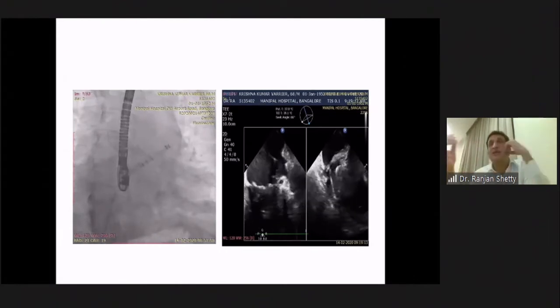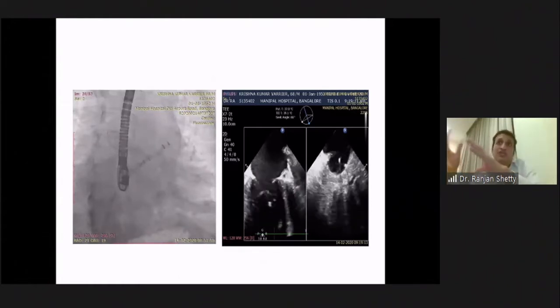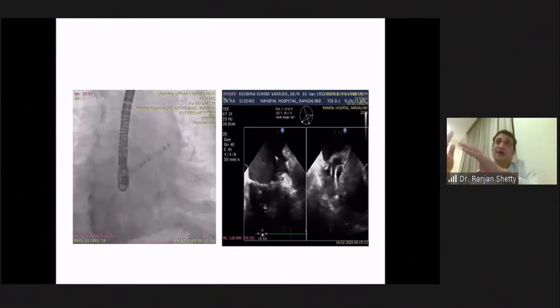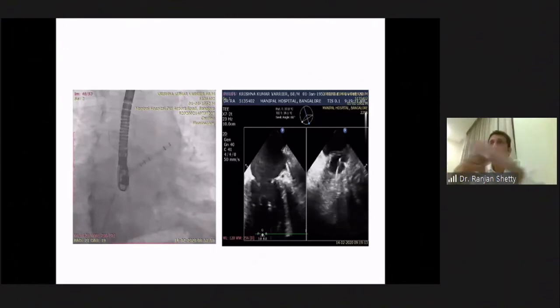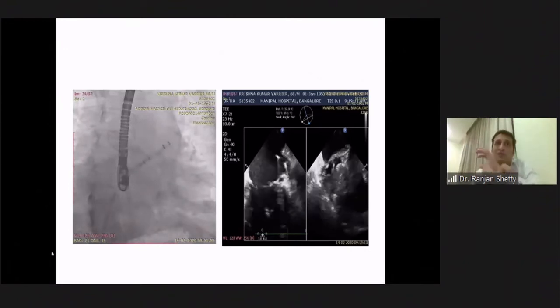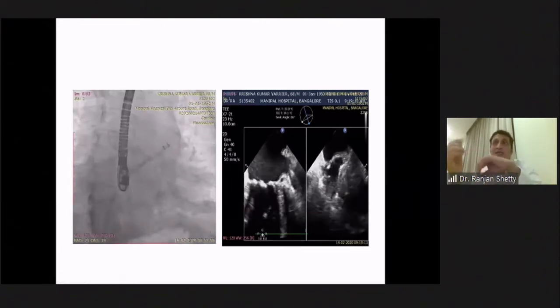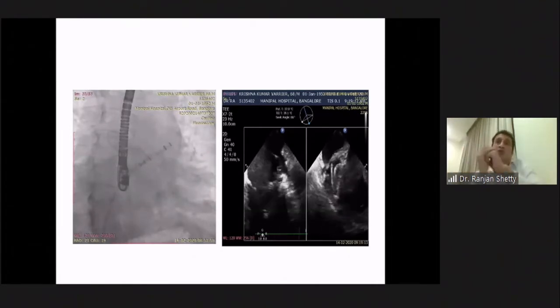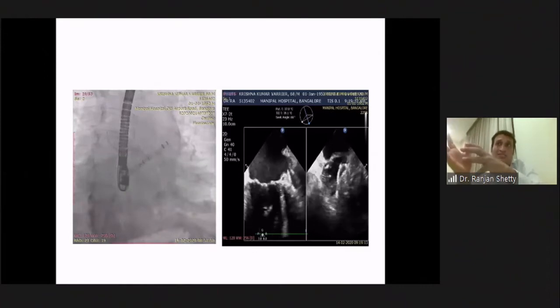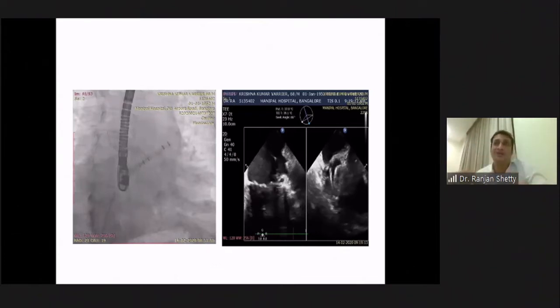Now that you have exchanged in the upper pulmonary vein, you take the WATCHMAN-specific sheath, which is a 14 French sheath, and you take it to the left upper pulmonary vein. Once you have done that, the dilator comes out, and you de-air the system. So now you have a WATCHMAN sheath which looks something like this, but in the left upper pulmonary vein. At this point, take a pigtail and advance it beyond the WATCHMAN sheath. So you have a WATCHMAN sheath and pigtail in the left upper pulmonary vein. The whole system could be withdrawn down, and you could pass the pigtail.